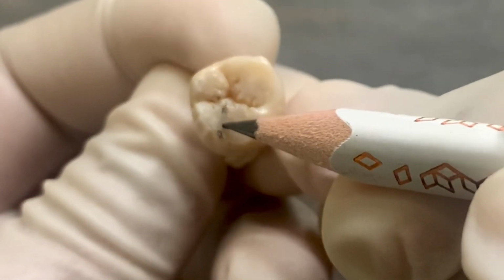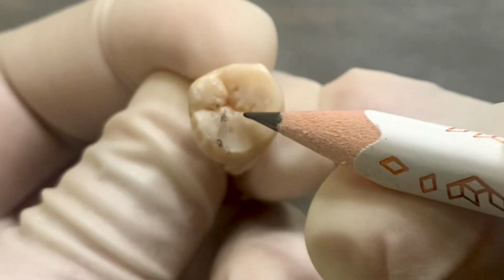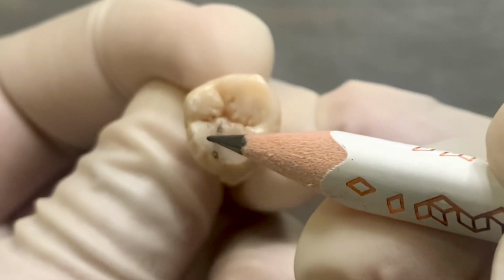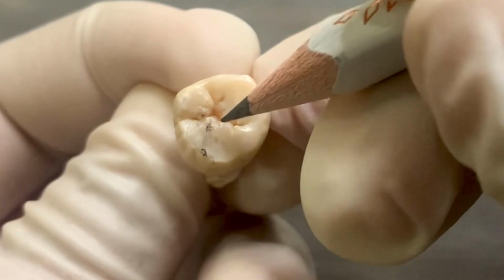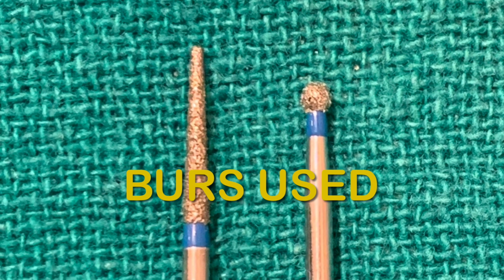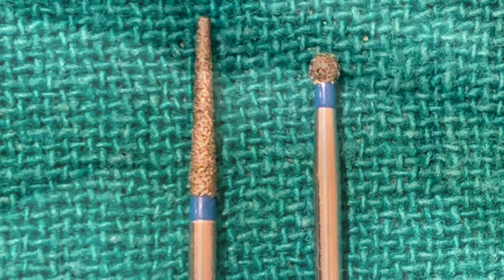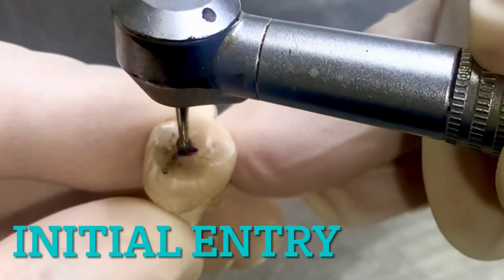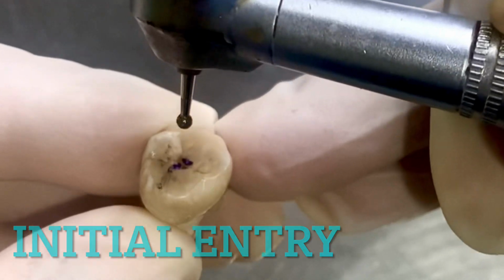Since the occlusal surface is attritioned, I have drawn a line to demarcate the cusps. This is the mesiopalatal, mesiobuccal, distobuccal, and distolingual. Now in the central pit present, we will start our access cavity. We start the cutting using a round burr. We position it on the central pit, hold it perpendicularly, and tilt it slightly palatally to start the cutting.